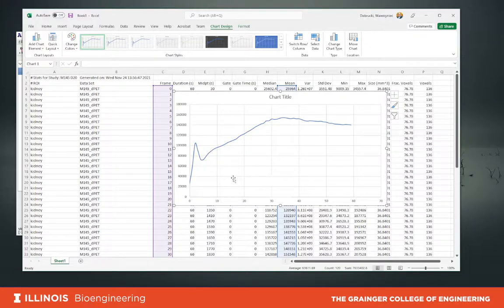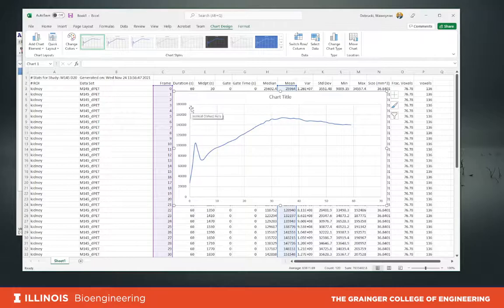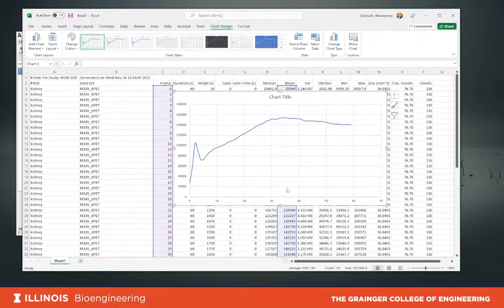Of course, if you are analyzing the blood pool using a region of interest placed on the heart, lung, or vessel, the shape will be completely different. In the blood, there will be very high activity early on, and then it will gradually decrease with exponential decay, going down to reach almost zero at 60 minutes.